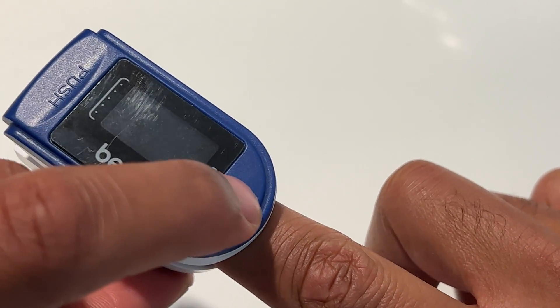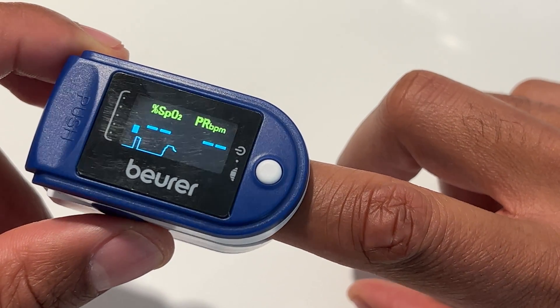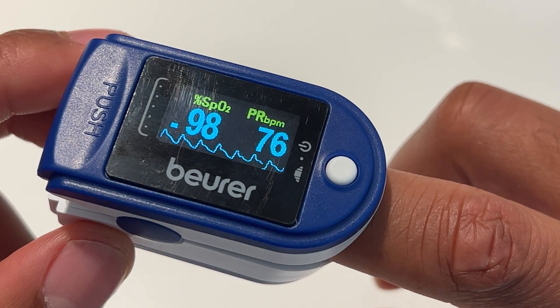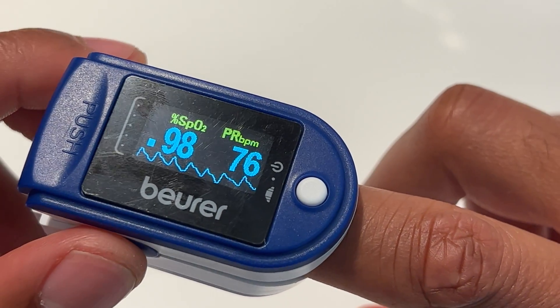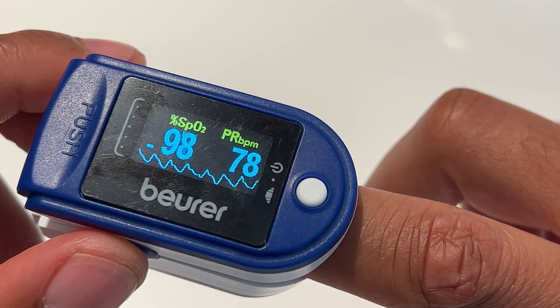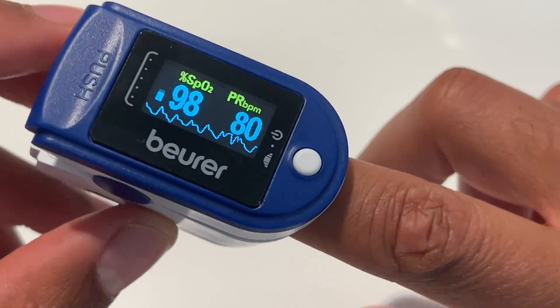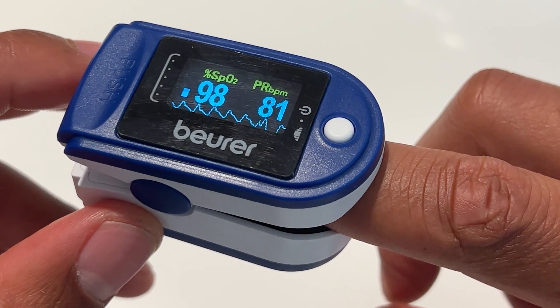I'm going to put my finger inside of the pulse ox and press the button on. It's starting to read right here. It's going to give me the beats per minute, and there is the oxygen level — it says 98. The pulse rate is 79 beats per minute.